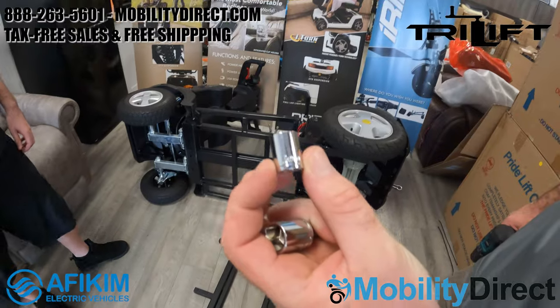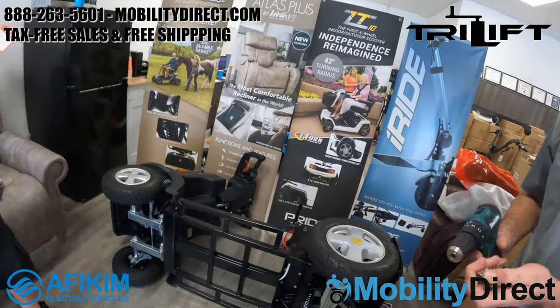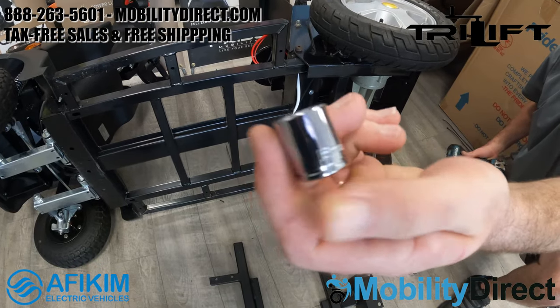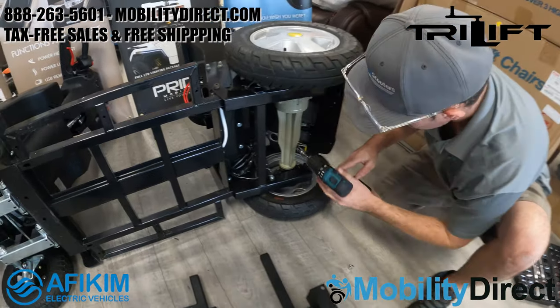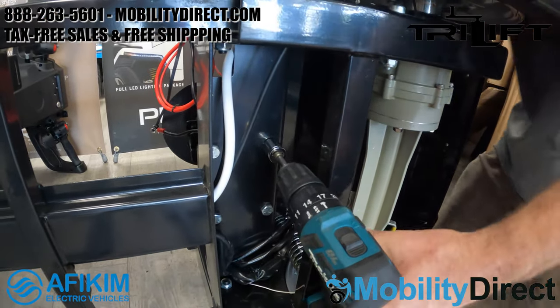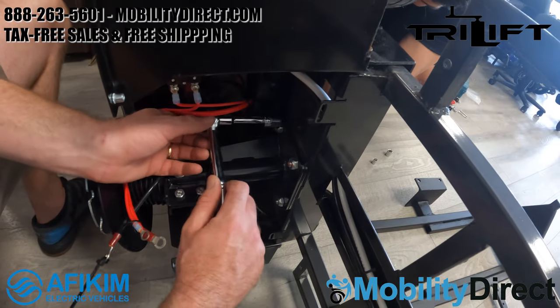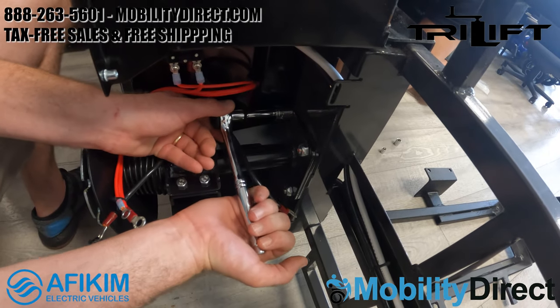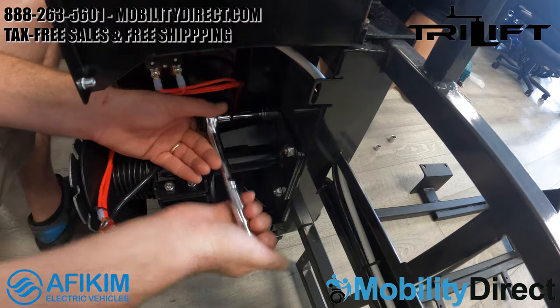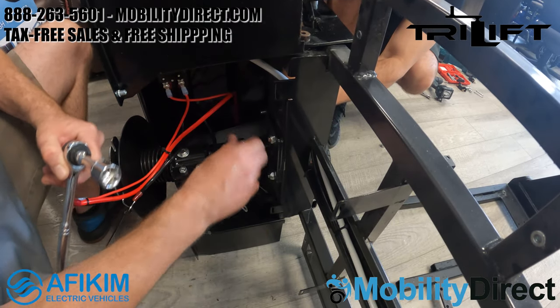You're going to need a 14-millimeter, a 12-millimeter socket, and a couple of others — 16-millimeter. You may need a whole drill bit set to get this entire process done, so make sure you have a drill bit set handy. What we're doing now is removing the two rear bolts that are used to hold the seat post in place. You don't need to remove the front bolts, just the rear bolts for the seat post assembly.